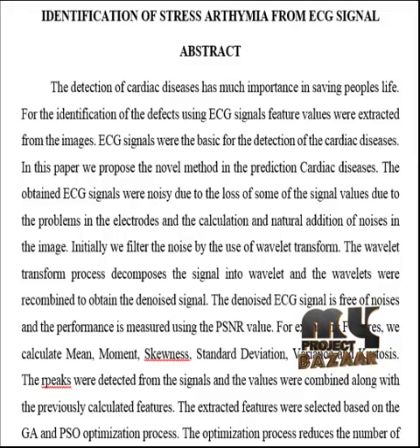The obtained ECG signals were noisy due to the loss of some of the signal values due to problems in the electrodes and the natural addition of noises in the signals. Initially, we filtered the noise with the help of wavelet transformation.